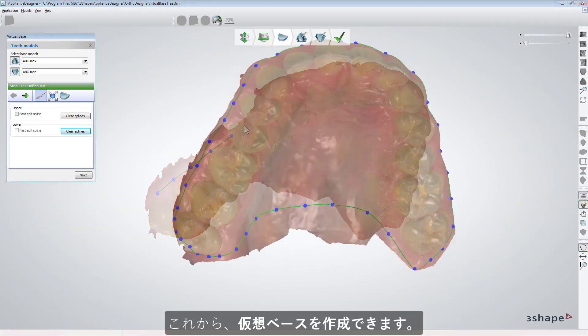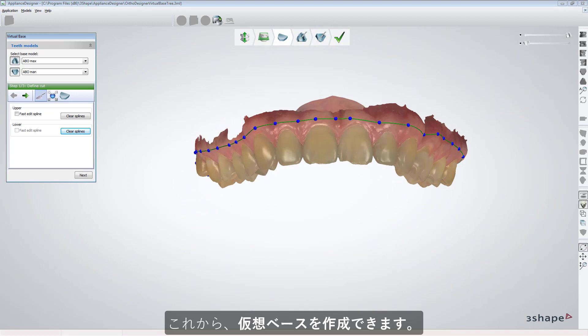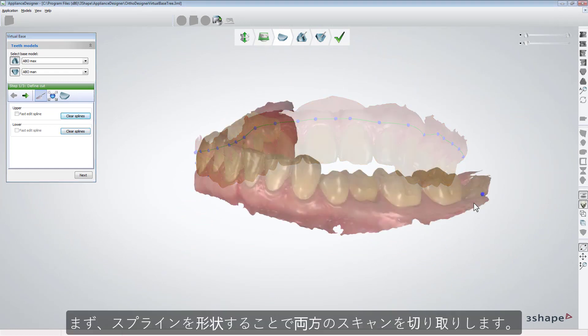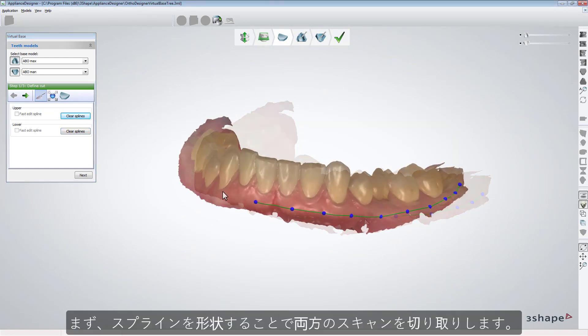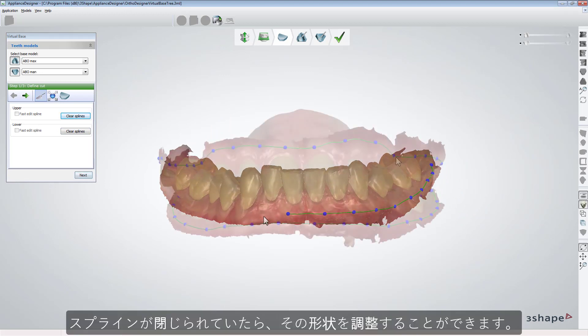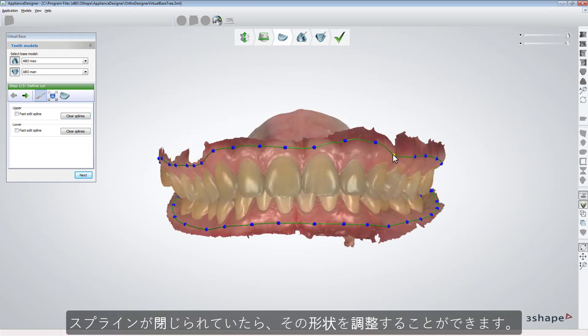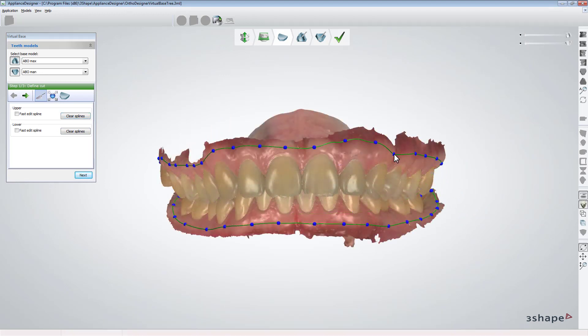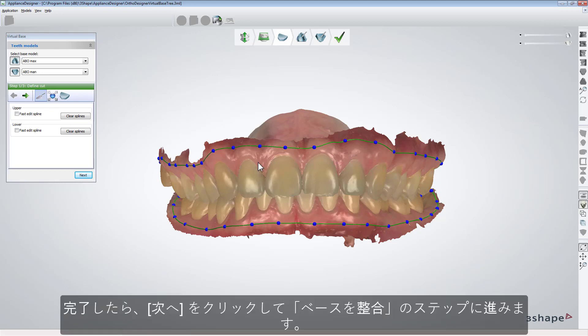Now you can create a virtual base. First, trim both scans by drawing splines. Once splines are closed, you can adjust their shape.